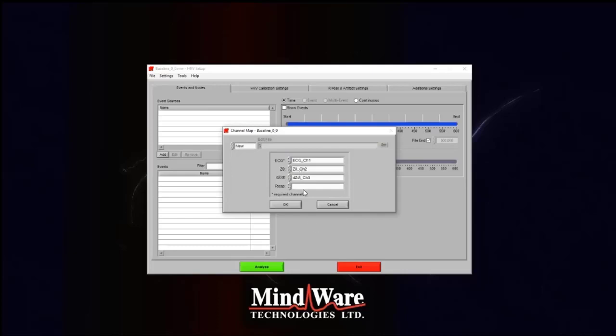In this case, we are going to talk about respiration quite a bit. And in this study, some other measures were also collected that we will cover in future webinars. One of those is impedance cardiography. Basically, that's where we induce a little bit of current through the chest, and we see that change in conductance of the blood. In that way, we're able to non-invasively track blood flow.